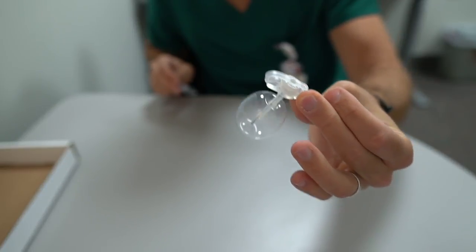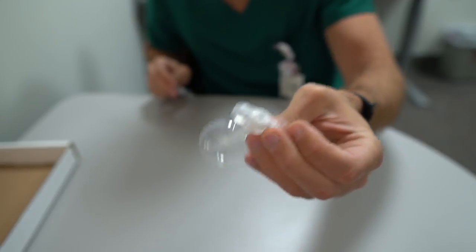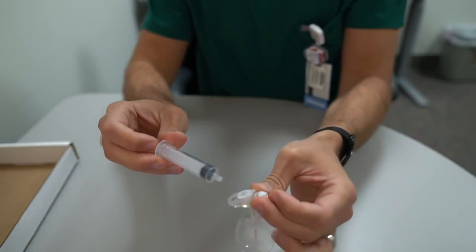I could obstruct the lumen of their stomach and that would be no good. So basically I would defeat the purpose of this. I would give them a little gastric obstruction. That would be poor form. All right, back to it.